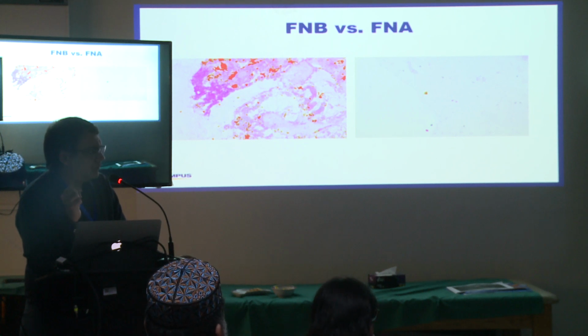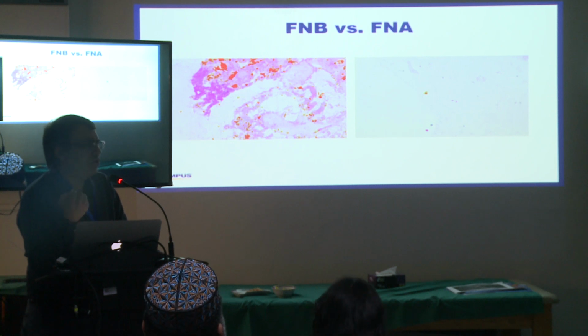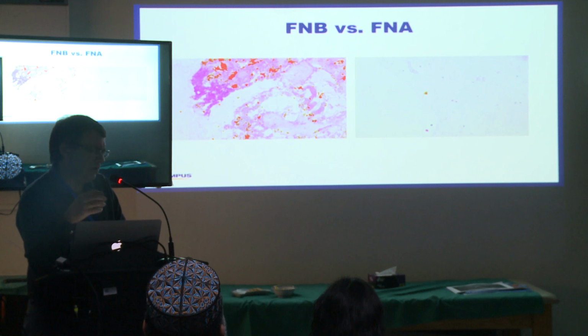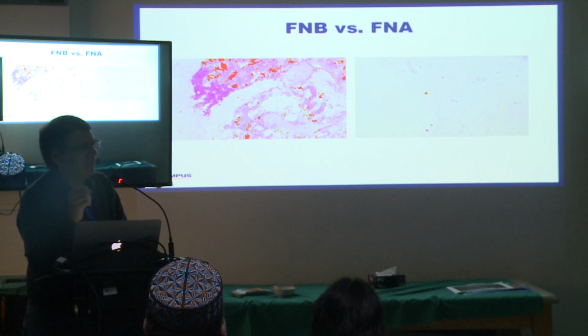Talking to Asim Yusuf, he says that even for access to the duct, he doesn't use 19 gauge, he uses a straightforward 22 gauge. It depends. A 22 gauge needle will only take a .018 wire. It depends on what type of interventions he is doing.